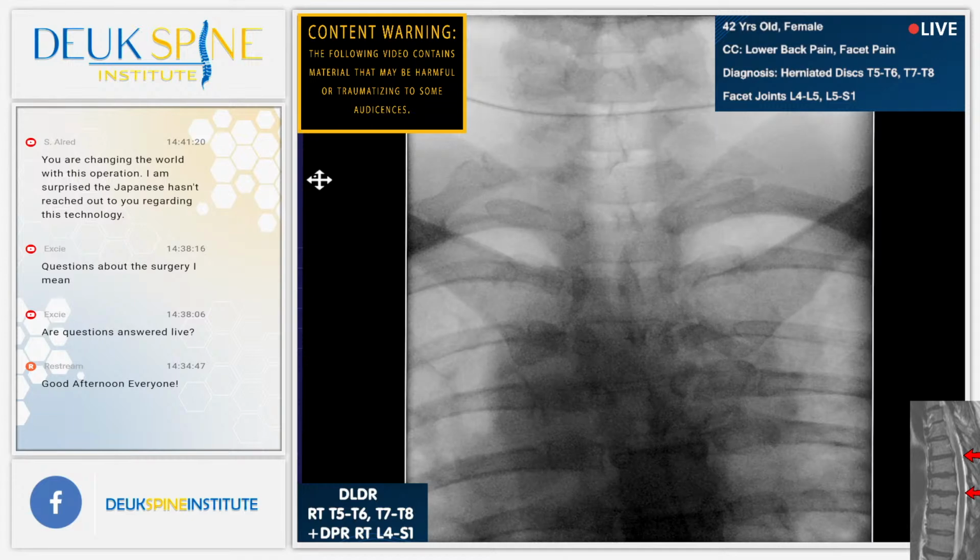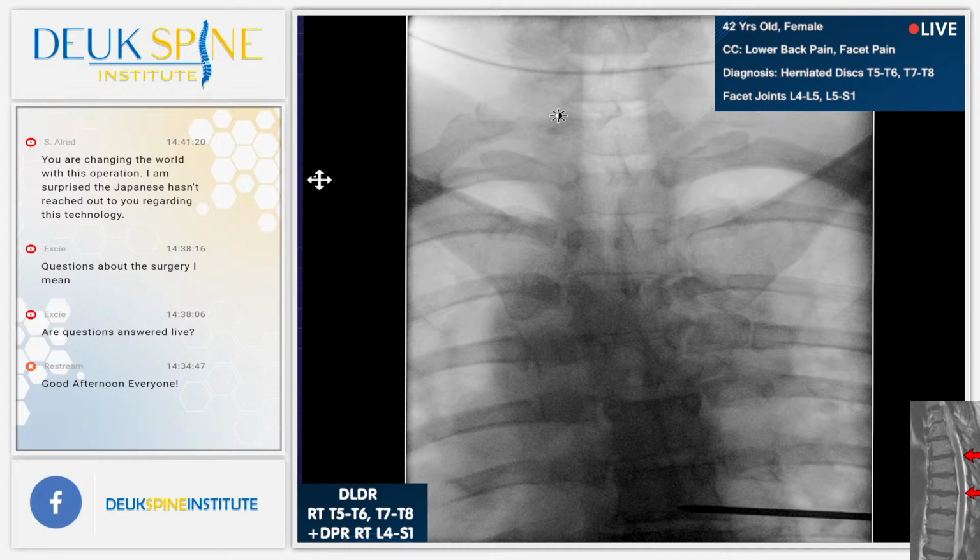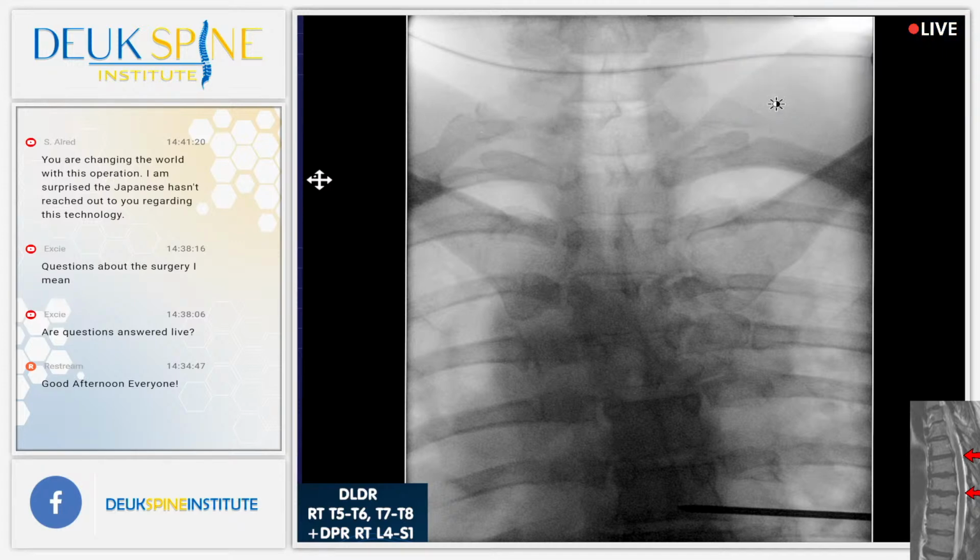Shot. Okay, so there's the first rib right there. You see it? It's easier to see on that side. Then the second rib is T2. You agree? If that's 2, then let's keep counting down. Just move the fluoro a little bit down. So really we're seeing the first rib on the left side better. Strange, isn't it? She has a weird rib on the right side. I'm not really seeing a very good rib. But all right, let's count down on the left side.